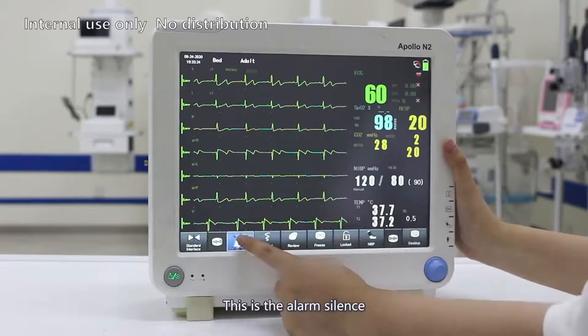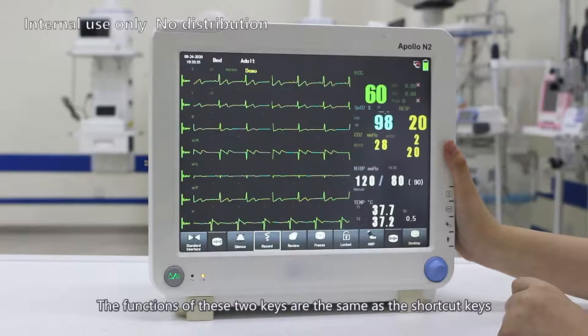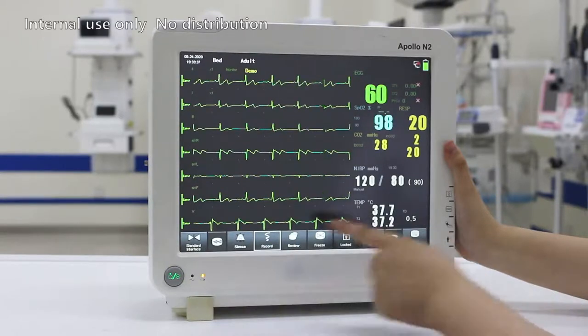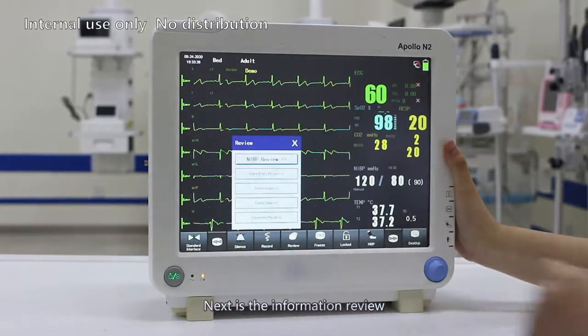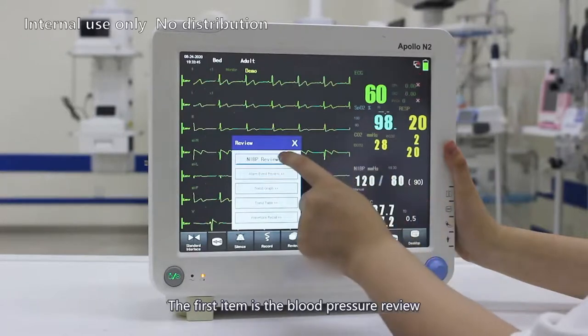This is the alarm silence. This is the record key. The function of these two keys is the same as the shortcut keys. Next is the information reviewing. There are 5 items here. The first item is the blood pressure reviewing.